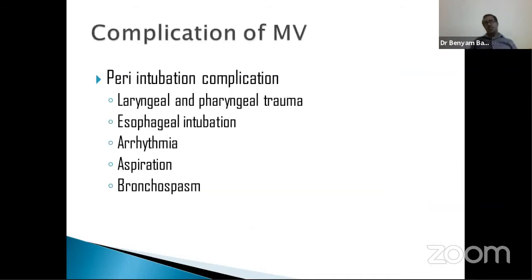So we have discussed mechanical ventilators, the modes, mode of delivery or mode of receiving, the individual modes, and how to improve oxygenation in a mechanical ventilator, and how to improve ventilation. And we have discussed the usual common alarms and alarm settings. And the final part would be the complications of mechanical ventilators. So there are many complications related with mechanical ventilators.